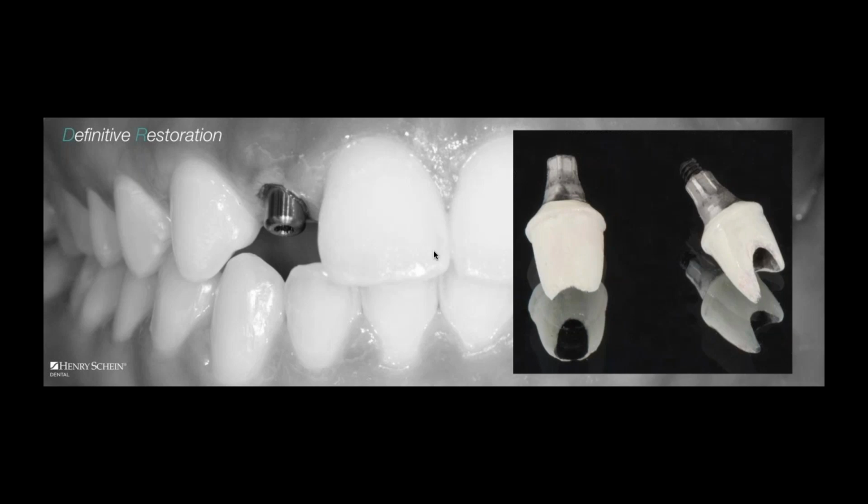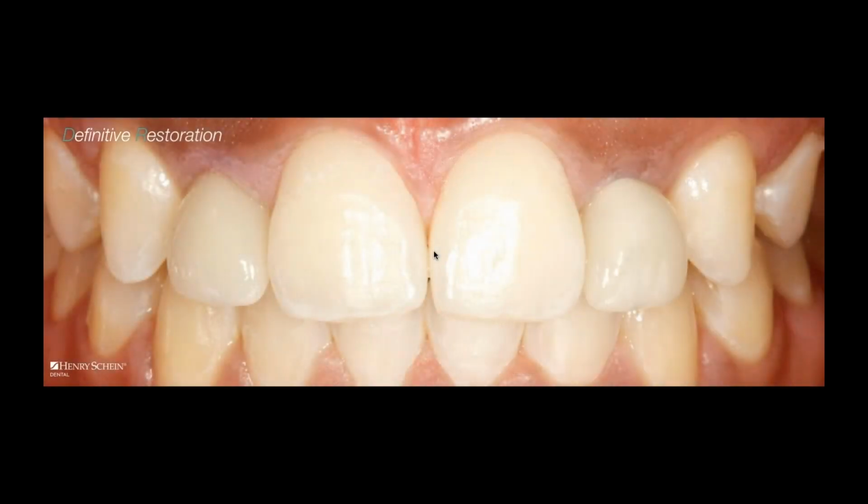And if that wasn't bad enough, here's the clinical outcome. Now, when you look at this, you say, something doesn't look right. The laterals are too short. And when we look at this and we see that the laterals are too short, we know it's because the implants were placed too shallow. Now, ladies and gentlemen, I want everyone to understand that this is 100% a therapeutic failure on day one. This is not successful therapy. This is a failure of therapy.